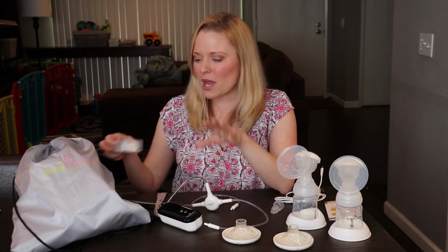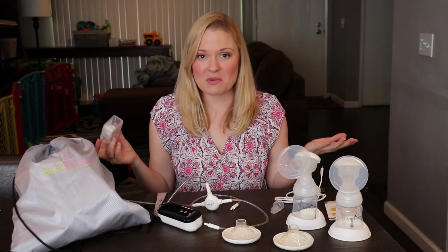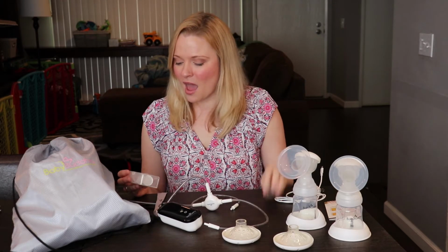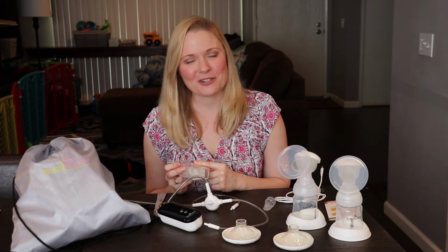So while Baby Buddha doesn't recommend using the duck-billed valves, I don't know why, because I actually found this to be a problem in my suction, and the duck-billed valves are cheaper and last longer and are easier to clean.